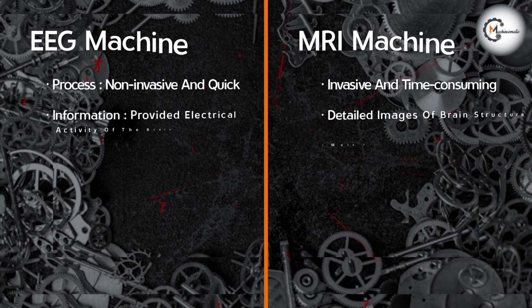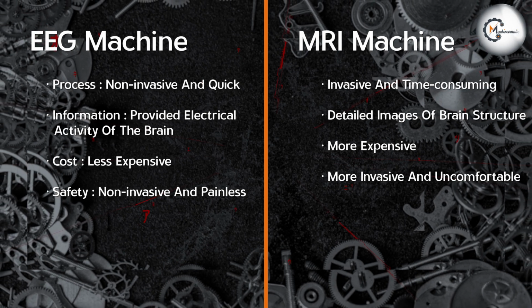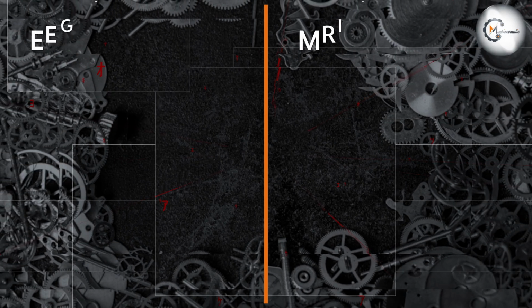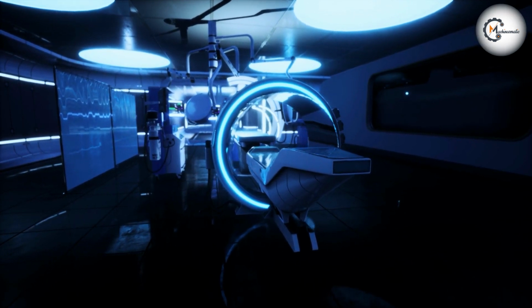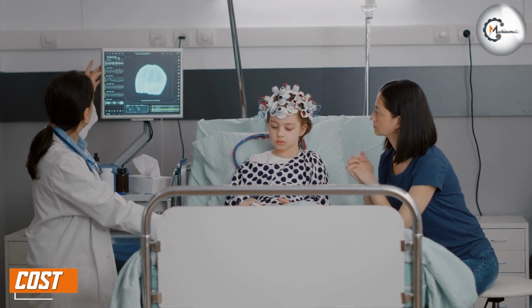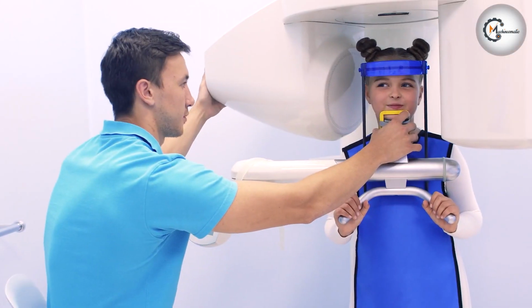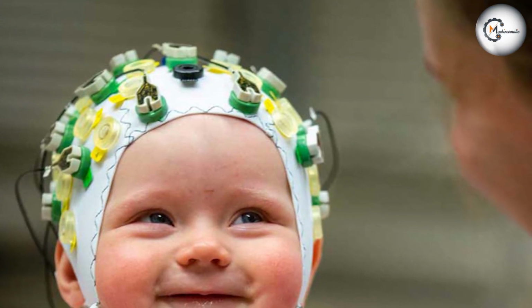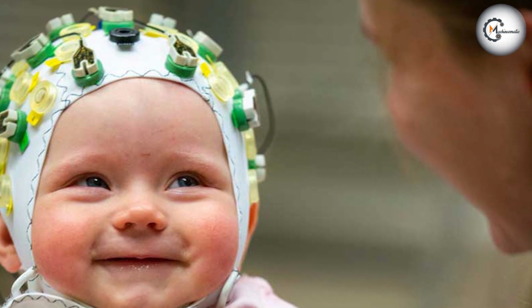This information can be used to detect abnormalities in the brain structure, such as a tumor or other physical abnormalities. In the case of autism, MRI can be used to detect differences in brain structure or size that may indicate a neurological issue. EEG is generally less expensive than MRI. This is because EEG machines are smaller and less expensive to maintain than MRI machines. EEG also requires less time for the procedure, which can reduce the overall cost.